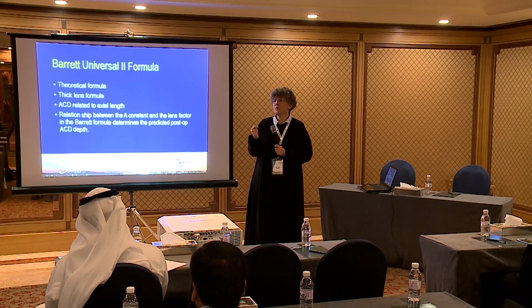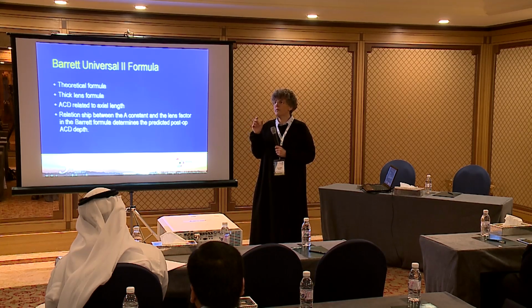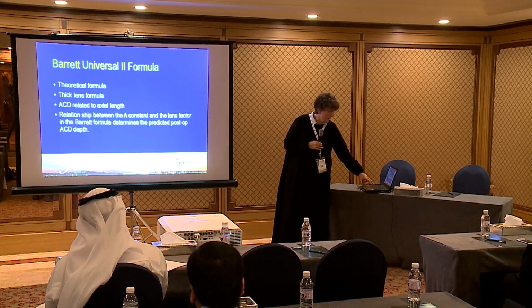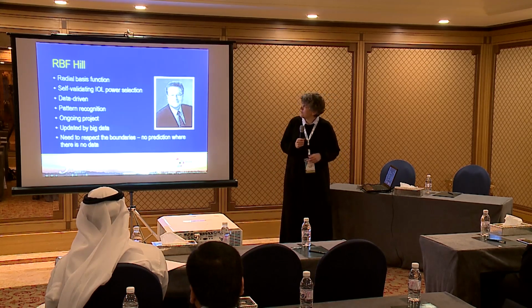If you look at the literature, you will see that the ACD will increase in depth by a mean of 1.47 millimeters. This is an article from Turkey from about 30 years ago. So we know that it gets deeper. And we know more or less how much, but we don't know how much in every eye. Now, this is Warren Hill.